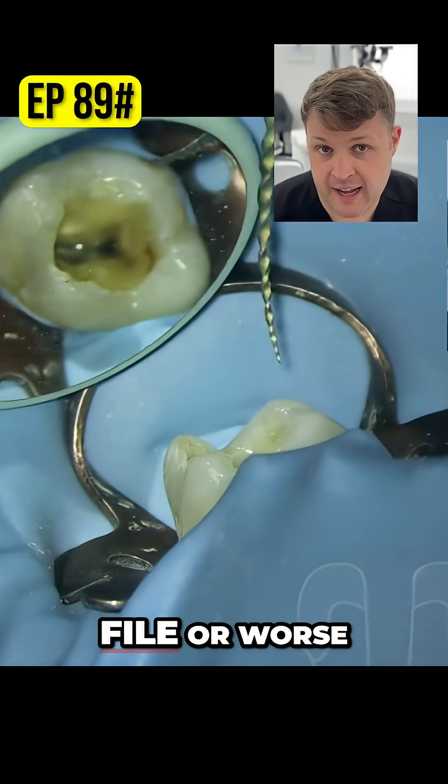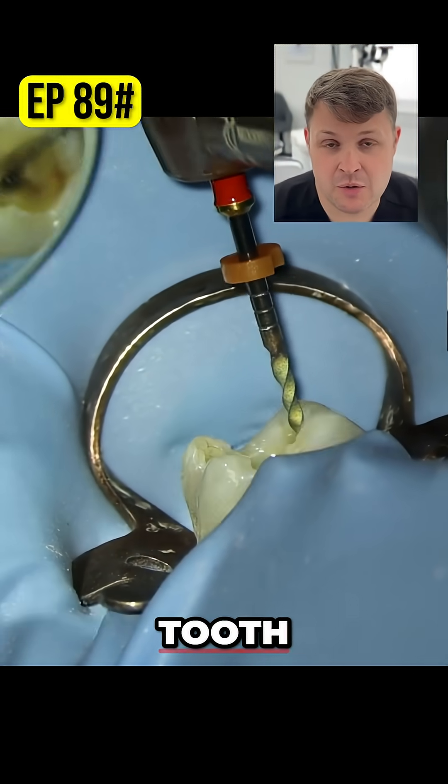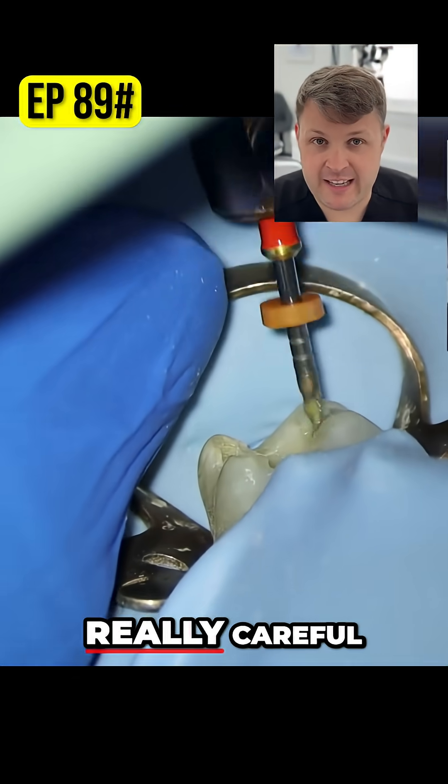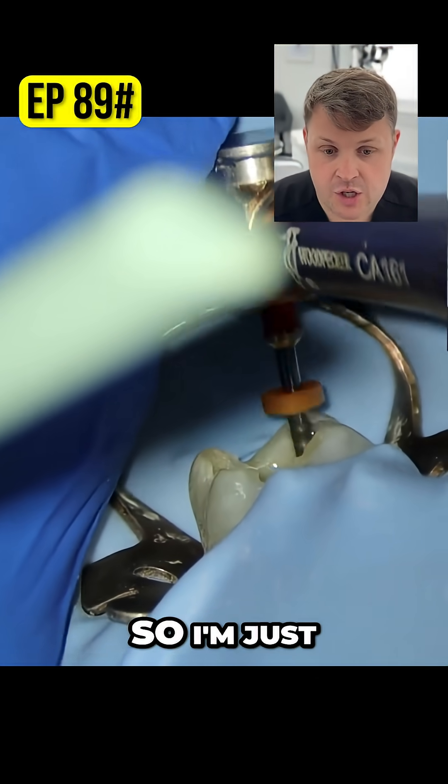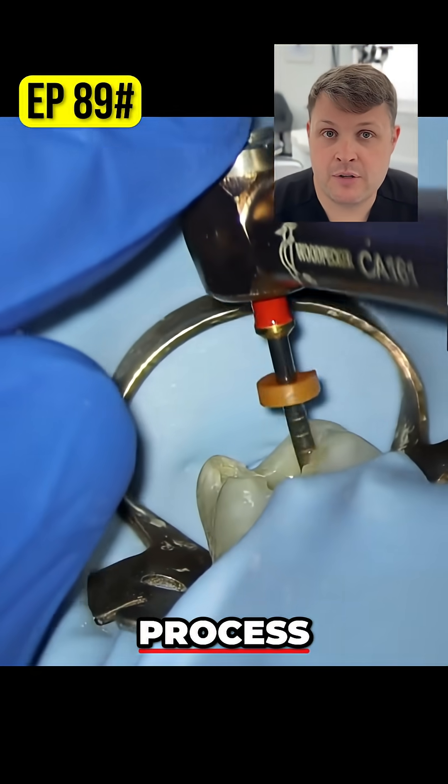Super, super careful — you don't want to fracture the file, or worse, ledge the tooth. So just be really careful. I'm happy that the 20 has gone to length.